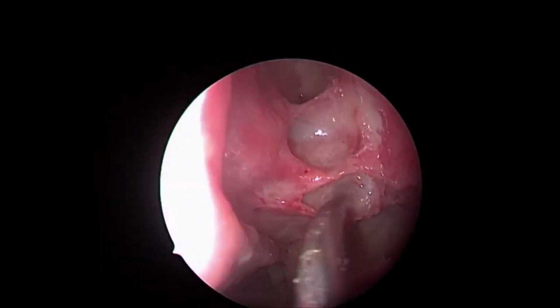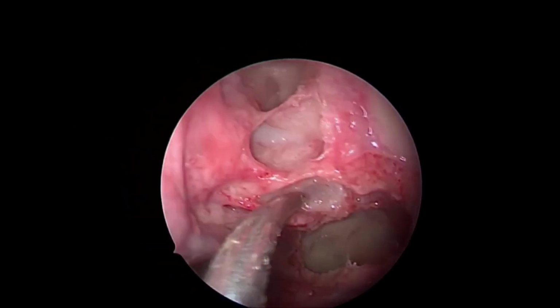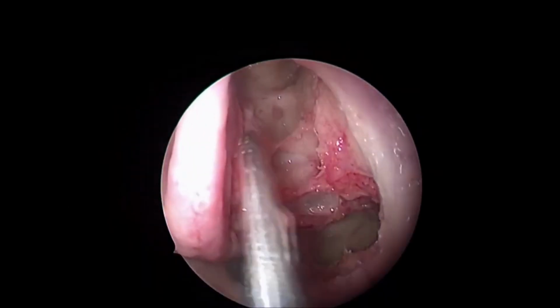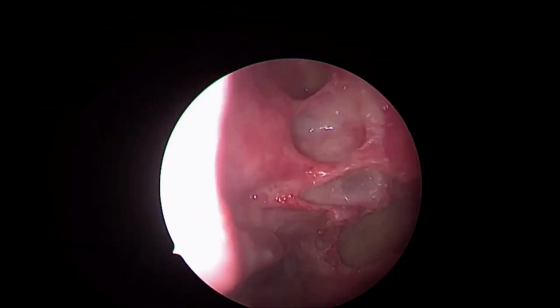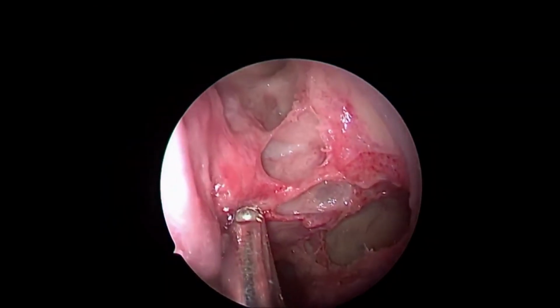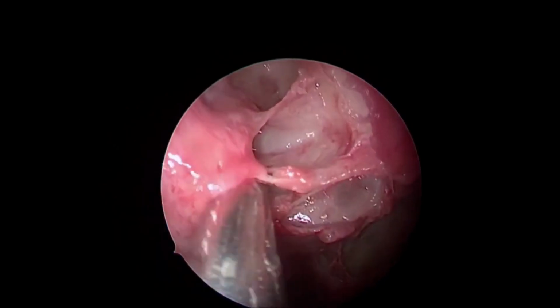This we call a life-saving line, a life-saving landmark. See, draw a line parallel to the floor of the orbit, medially. This is the first part of the turbinate, this is the second part of the turbinate. In the second part of the turbinate, close to the first part, this is the point of entry into the ground lamella. This answers where to enter into the ground lamella safely.